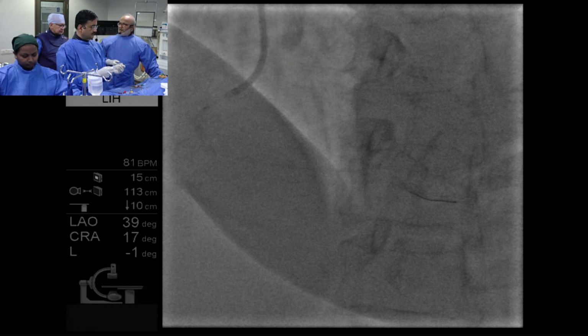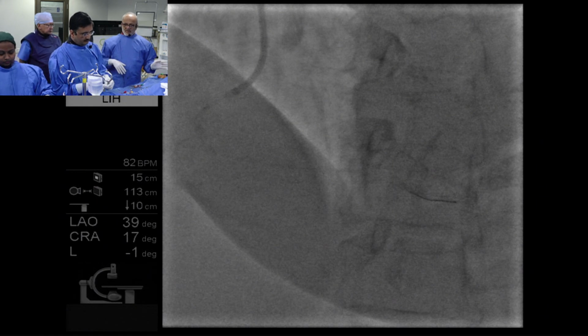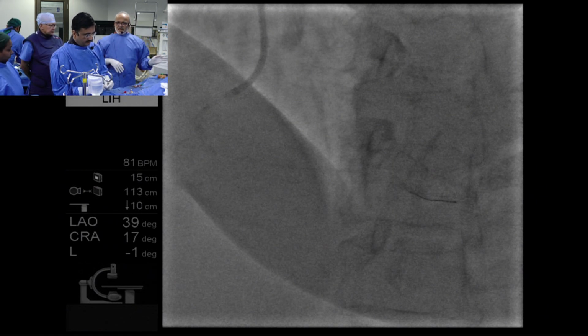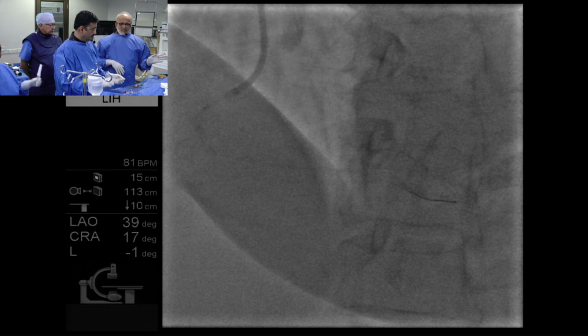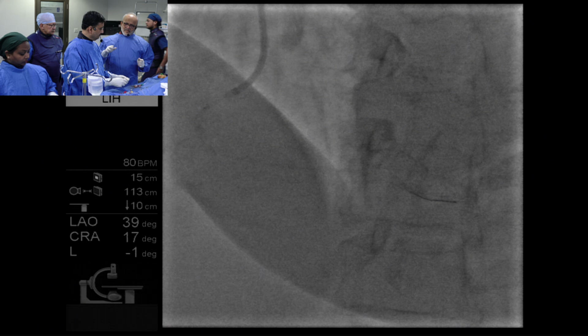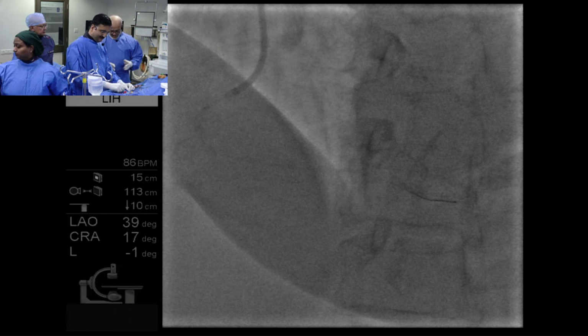We always feel that the vasodepressor component predominates and adrenaline works. And if need be, it takes another 1 minute to put in the pacemaker. But in our practice, Sanjay, how many times have we had to? Zero. As of now, we are lucky.